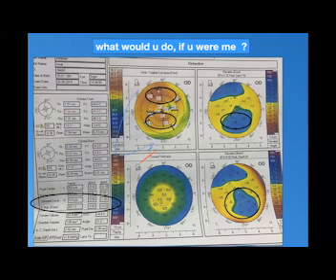So up till now, it's an irregular cornea, but not a keratoconic cornea. So I will go for refractive surgery, as Dr. Mahmoud said. But to skip the problems of the PRK with the hyperopia, I will do a flap. I will create a flap.